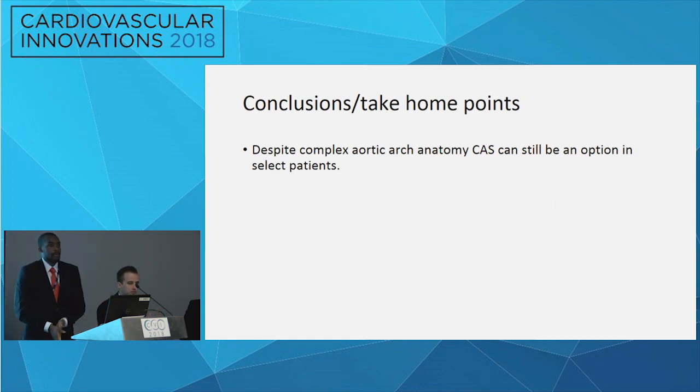Our main take-home point here is that even when operators are a little less experienced, they can still navigate this complex aortic arch anatomy in some select patients.